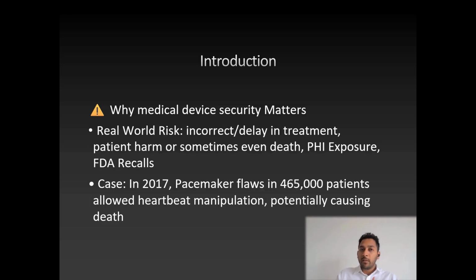If the device has the capability to update the software remotely, then we need to make sure we have solid security controls around that attack surface, the capability of updating the software remotely. So it's not just a technical challenge, it demands a 360-degree view across regulatory, operational, and human impact.